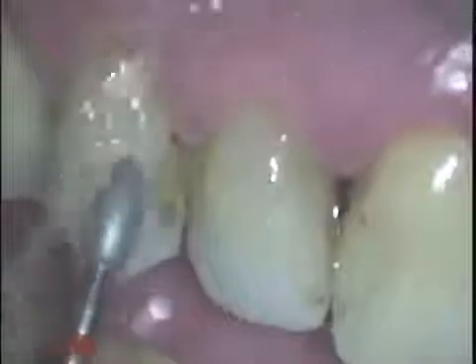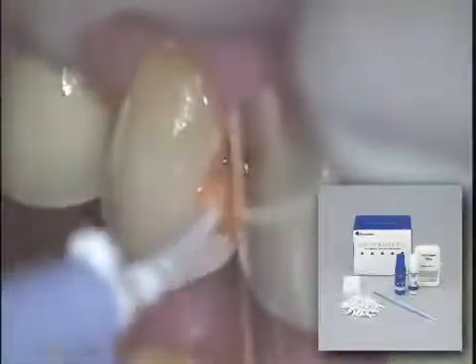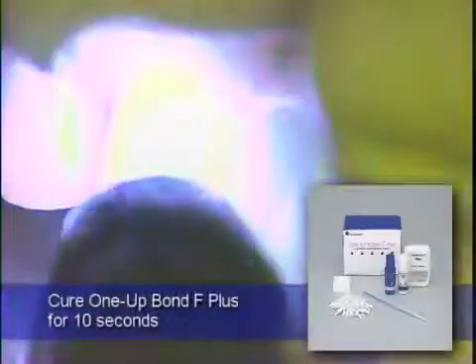Following this, a small amount of enamel is reduced at the cavo surface margin in order to allow the composite to easily blend into the tooth surface. A mylar strip is placed between the teeth and 1-Up Bond F Plus is scrubbed into the cavity preparation and the prepared enamel for approximately 10 seconds. The 1-Up Bond F Plus is light cured for 10 seconds.